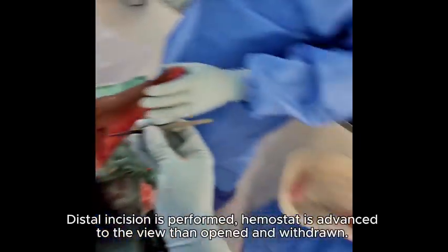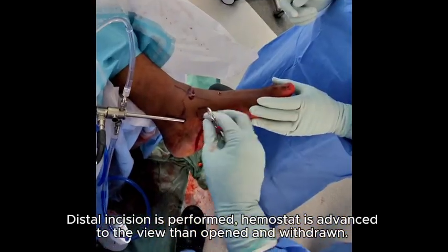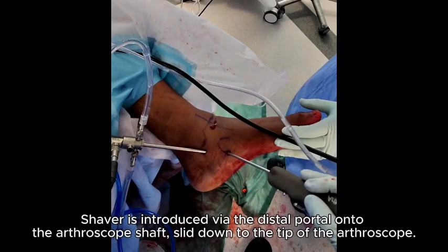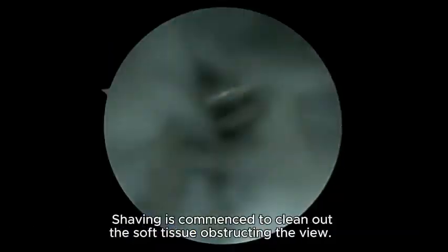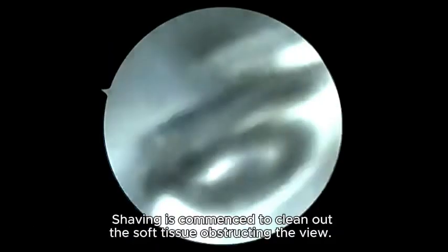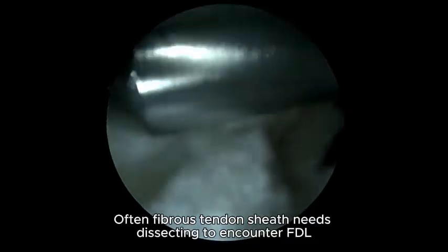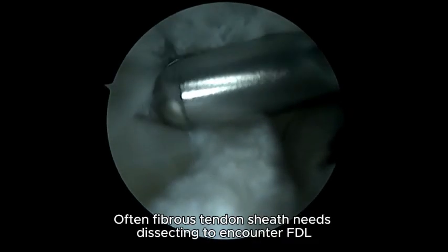Distal incision is performed. Hemostat is advanced to the view, then open and withdrawn. Shaver is introduced via the distal portal onto the arthroscope shaft, slid down to the tip of the arthroscope. Shaving is commenced to clean out the soft tissue obstructing the view. Often fibrous tendon sheath needs dissecting to encounter FDL.